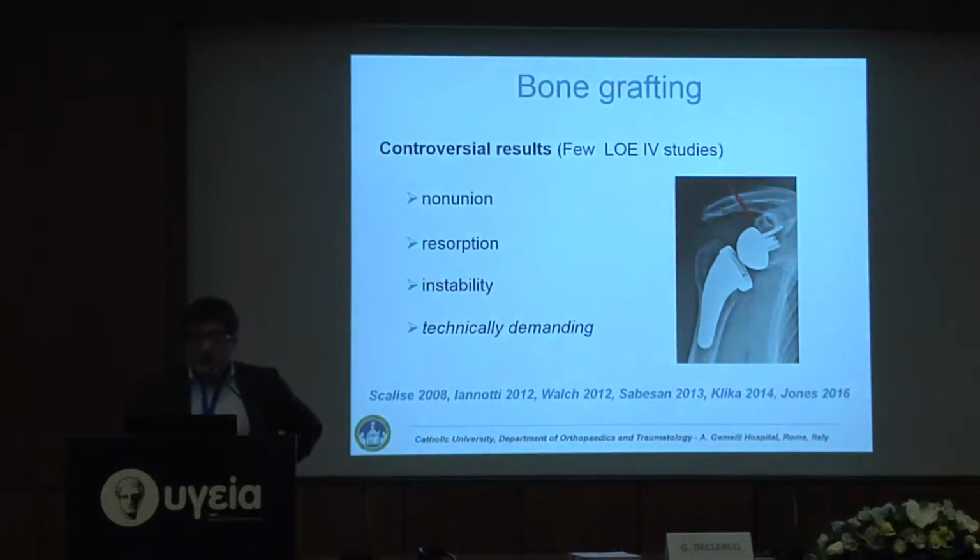For sure, controversial results have been reported with the use of bone grafting because of the risk of non-union, resorption and instability, and because it's technically demanding. Basically, Boileau reported 100% fusion of bone graft recently at the International Shoulder and Elbow Congress in Korea.